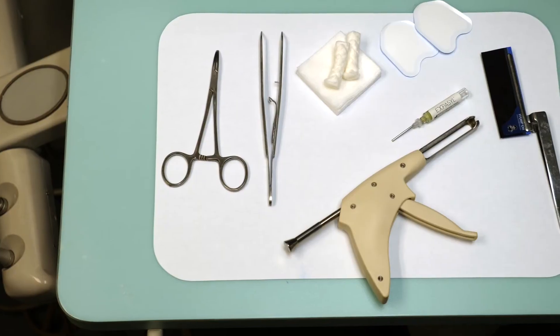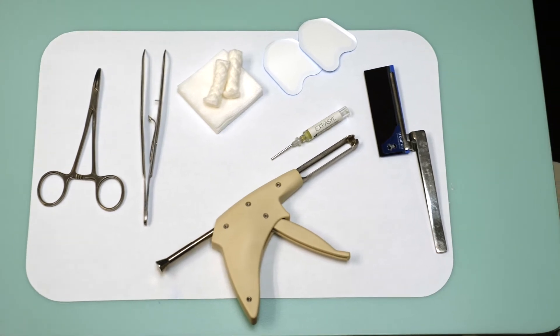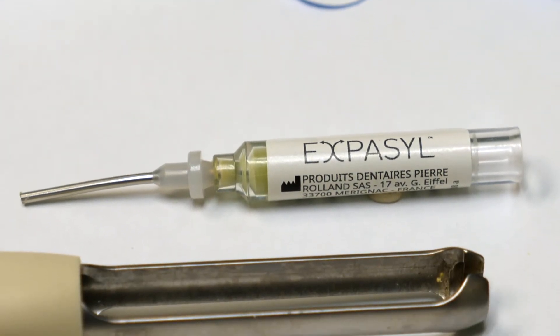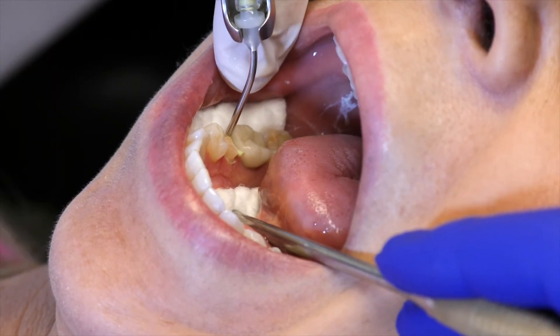We will learn about this product and find out what our evaluators had to say about using it in their practices. To reduce the pain and potential epithelial attachment damage and bleeding caused by traditional retraction techniques, Acteon offers Expasyl Paste. With no cord, clinicians can achieve predictable retraction and reliable hemostasis.